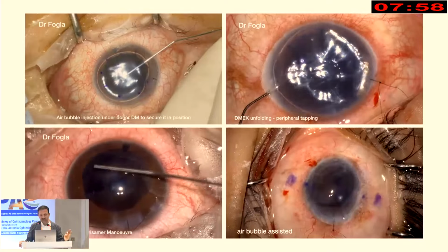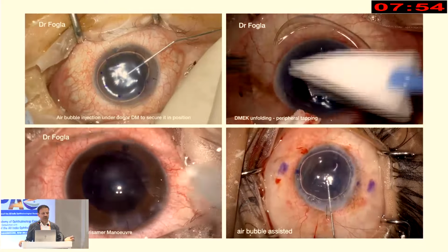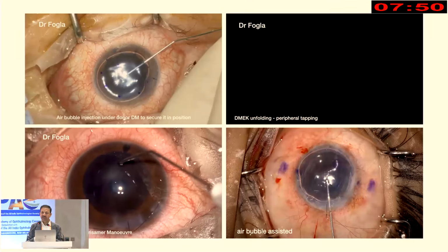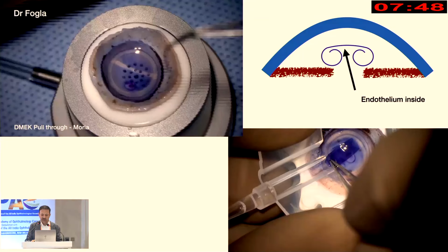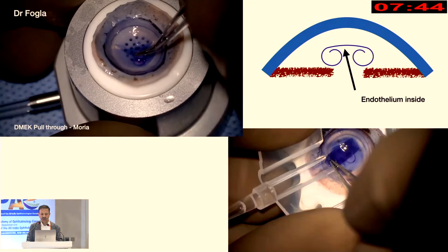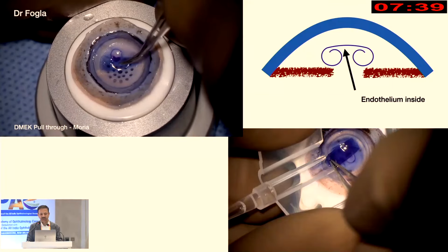You can do that even without removing the air bubble. You can straight away put an air bubble below, and the air bubble on top will move to the side, but sometimes that can affect your centration of the DM scroll. There is also the endo-in technique, which Donald Tan likes using with the Endoglide. Even Massimo Busin has shown this technique with a contact lens.